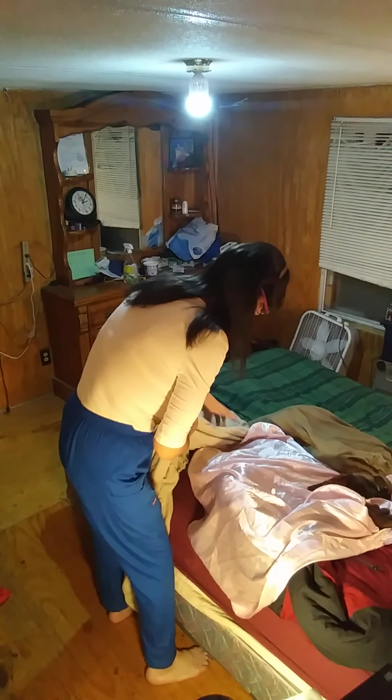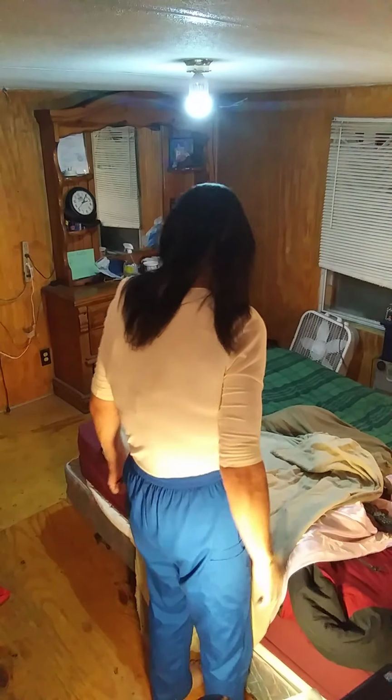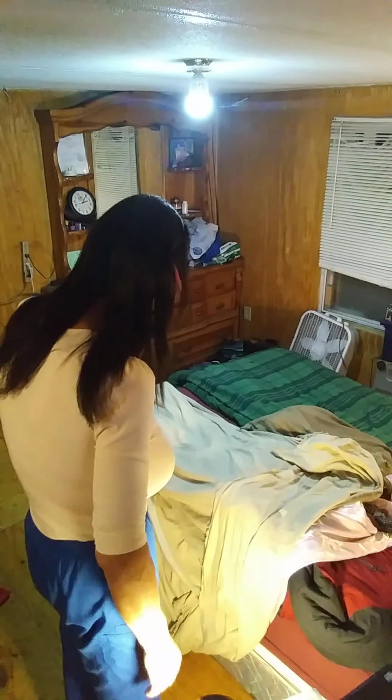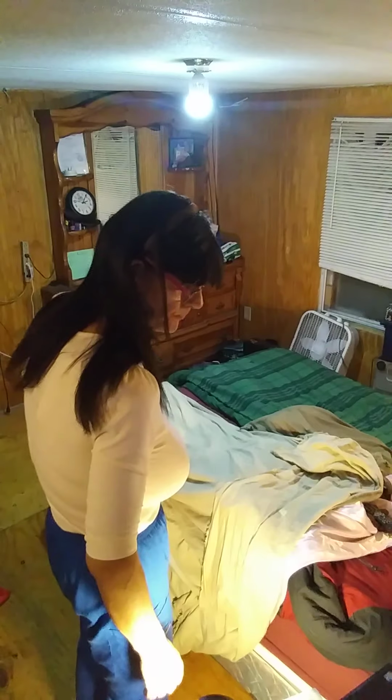And I'm going to put her blanket back up. I'm going to provide comfort. I'm going to give Miss Cheswick her call signal. Put it right in her hand. Her bed is in the lowest position. The wheels are locked on the bed. She has her call light.